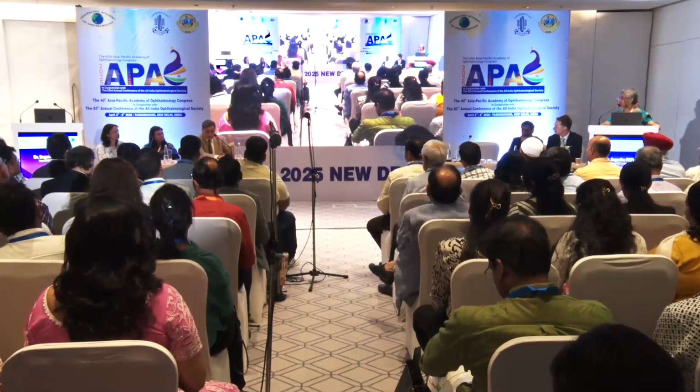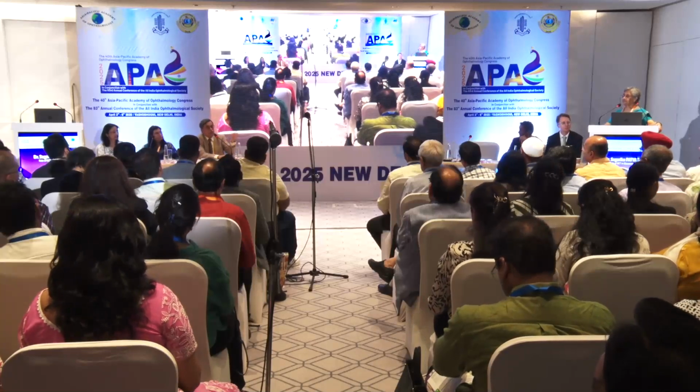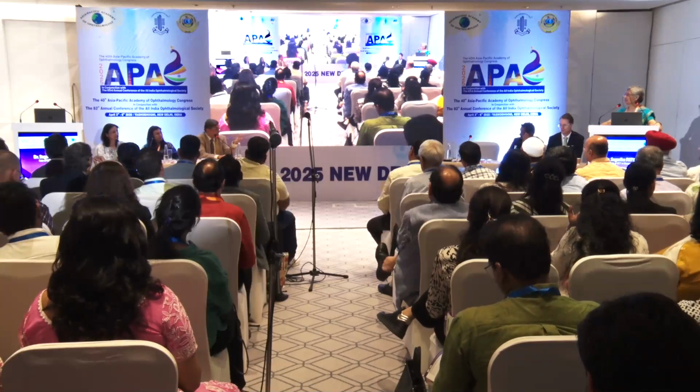I think one message was clear was that when you're evaluating the OCT, check the signal strength. If the signal strength is not good, you could get a misleading picture. That's one. The second thing is, changes in OCT can give you the basis for screening with a field, which takes much longer. And thirdly, if you have a situation where the OCT on a sequential follow-up is showing changes which are increasing, you may use it even for treatment. Absolutely. Also, in addition to this, if there are any other questions from the house, please go ahead.